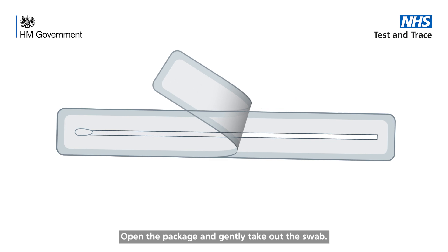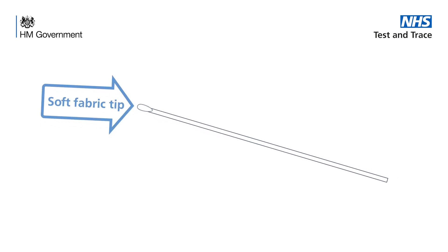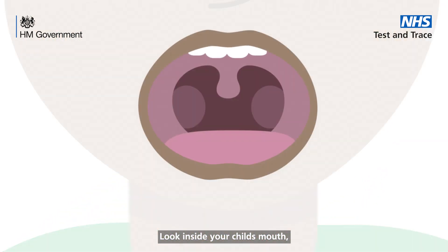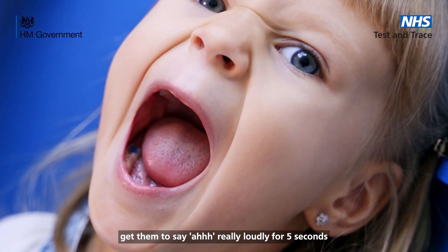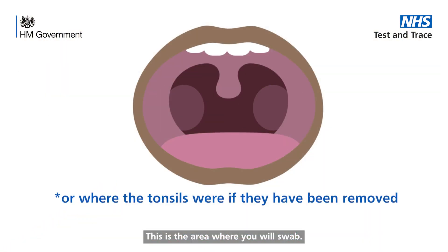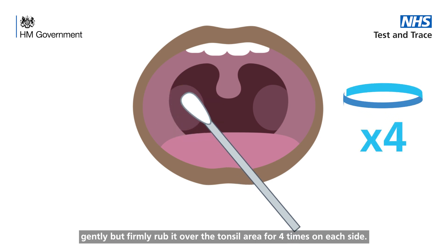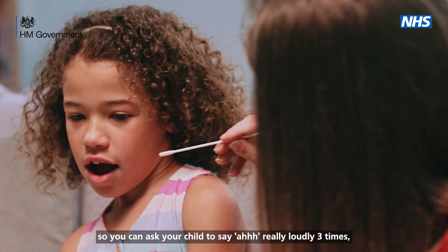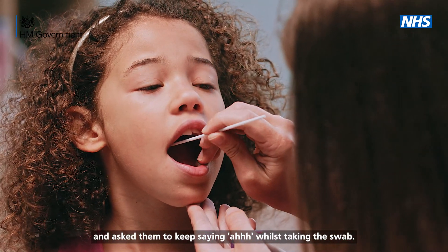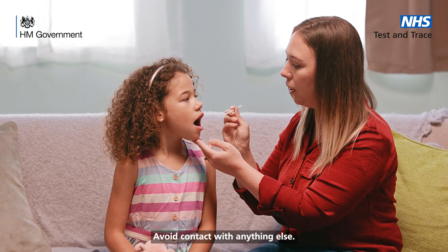Open the package and gently take out the swab. Take care not to touch the soft end of the swab on anything apart from the throat and nose, as this will be used for both. The throat swab: look inside your child's mouth and get them to say 'ah' really loudly for five seconds so you can see the tonsils on each side at the back of their throat — this is the area where you will swab. Holding the swab in your hand, gently but firmly rub it over the tonsil area four times on each side. This may be uncomfortable, so you can ask your child to say 'ah' really loudly three times, then introduce the swab and ask them to keep saying 'ah' whilst taking the swab. Remove the swab from the mouth and avoid contact with anything else.